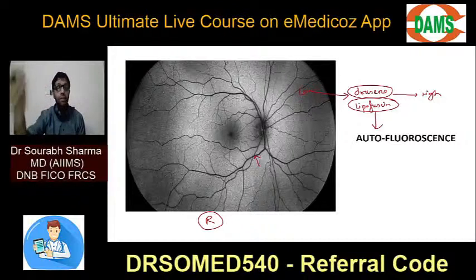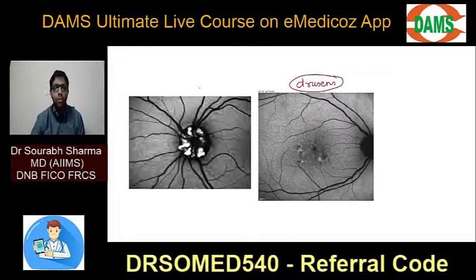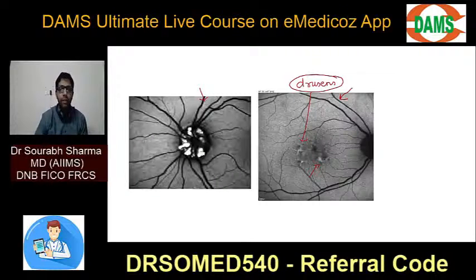A little advanced level. Look at these drusen, which I was mentioning in age-related macular degeneration. See, everyone can appreciate it is autofluorescence. Vessels are dark. These are drusen. Small, white, in age-related macular degeneration.